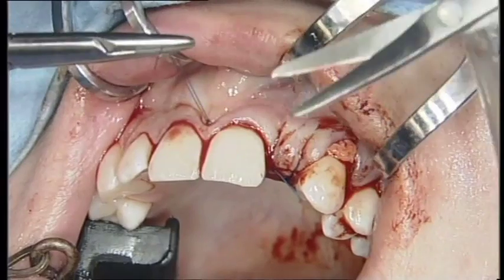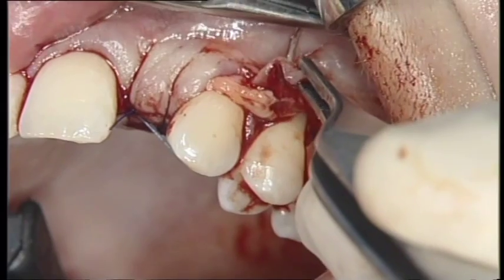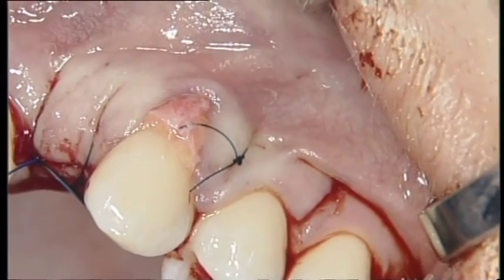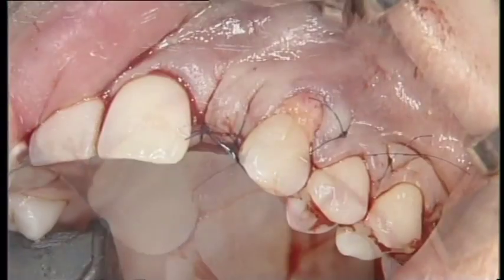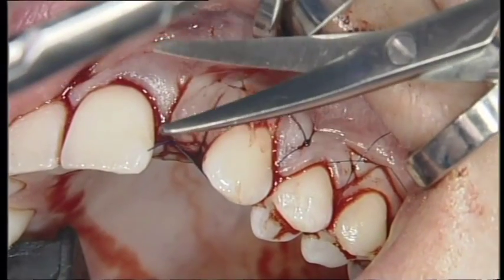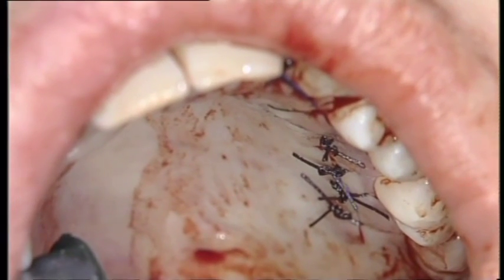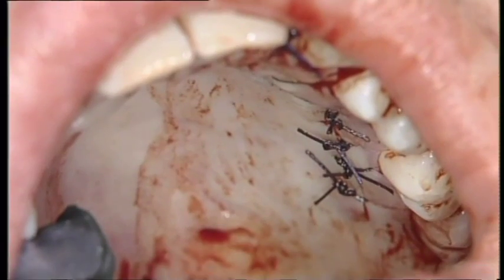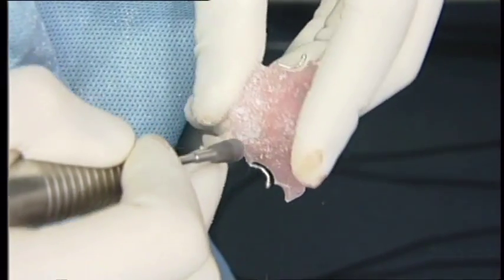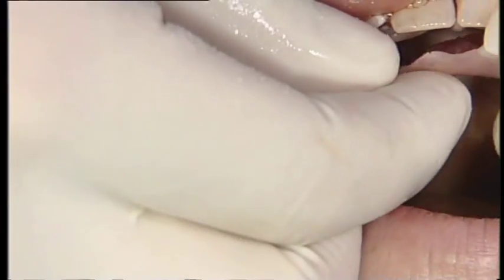Mattress sutures are used for the papillary areas, whereas the releasing incision is closed with 6-0 single sutures. An additional 6-0 suture is applied for the soft tissue graft to enhance its stability. The donor site is primarily closed with interrupted vicryl sutures. To avoid direct compression on the surgical area, the provisional denture is adjusted. The provisional denture is now put back into the mouth.